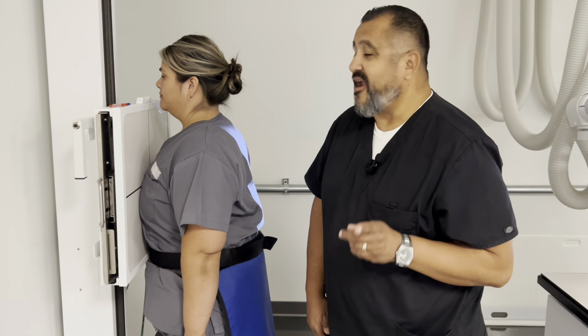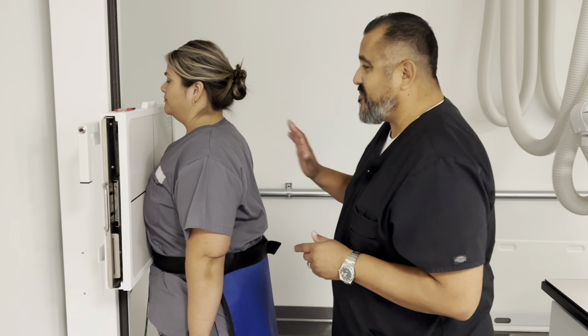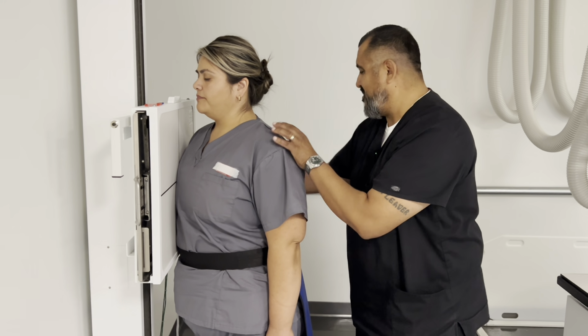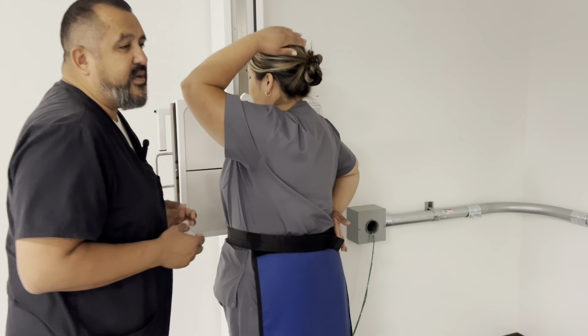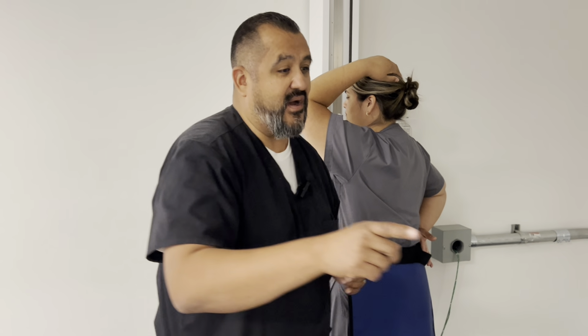Remember, RAO, right anterior oblique, is the position. Projection is a PA oblique, because what we're going to do is we're going to turn her body 45 degrees. We're going to bend this elbow back here, so she's going to be like this here. And this arm is going to be up. So people always wonder, hey, Mr. M, which arm should I put up? Well, the side of interest, that's the arm that has to go up, okay? So keep that in mind.